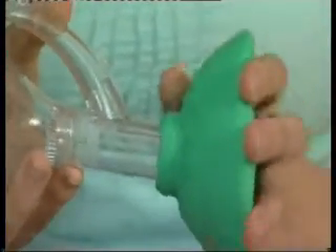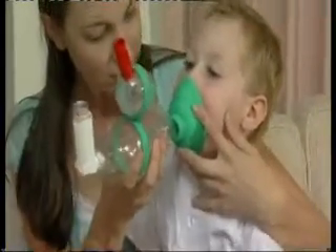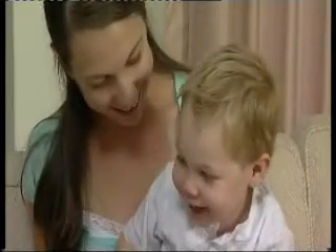The Funhaler, when used with a soft, comfortable mask, is effective for use with younger children. Gently press the mask over the mouth and nose, providing a secure seal on the face. The administration of medication is the same as demonstrated with the mouthpiece.